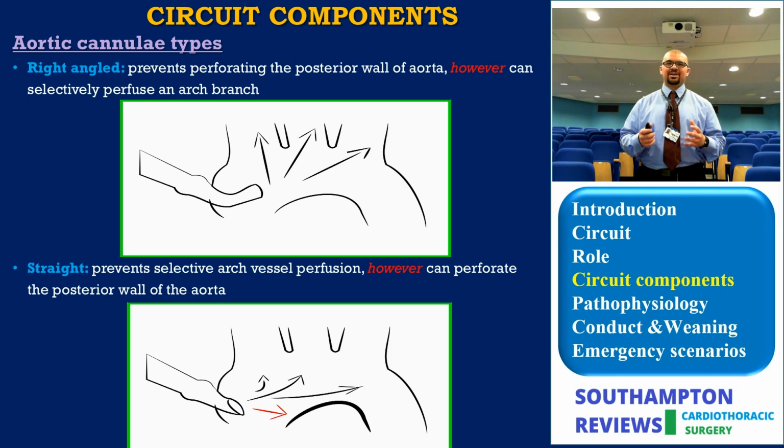Academically speaking, theoretically, when we study the types of cannula, we study them as characters of the tip, the body, and the additives. However, that's no longer the case. So there is nothing like a right-angled cannula per se only. You will find a cannula which has multiple features such as a soft diffusion tip, as well as wire reinforced, with a flange, without a flange, with a donut, without a donut, and so on.